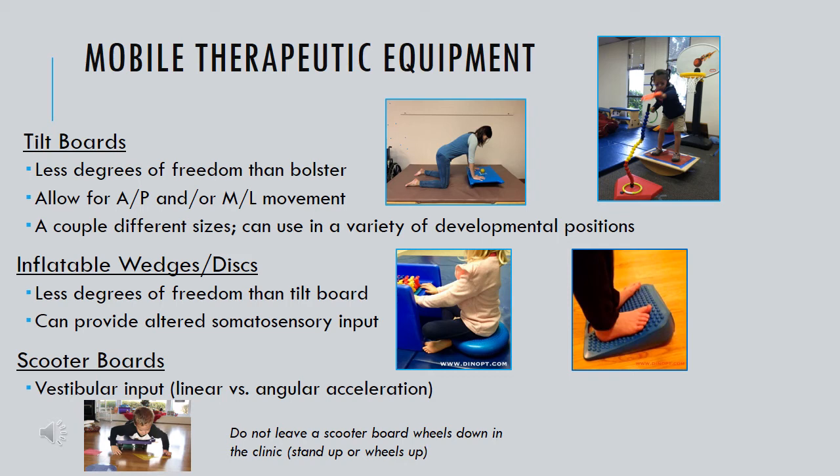Scooter boards offer mobility to the patient in terms of vestibular input, so you can think about that as either a linear or angular acceleration. Your patient could be in prone on the scooter board, they could be in sitting on the scooter board, and depending on your patient and the way you've decided to use the scooter board, you could address pieces such as core stability, symmetrical use of upper extremities, looking to add vestibular input into that activity. So many different applications for use of scooter board.